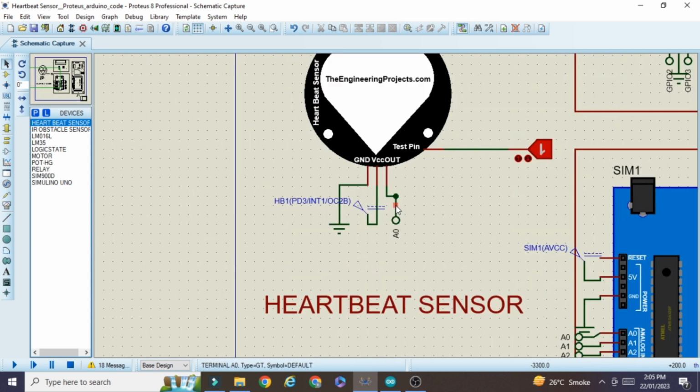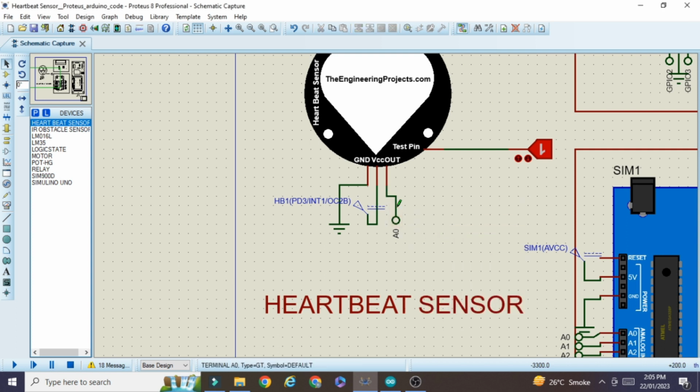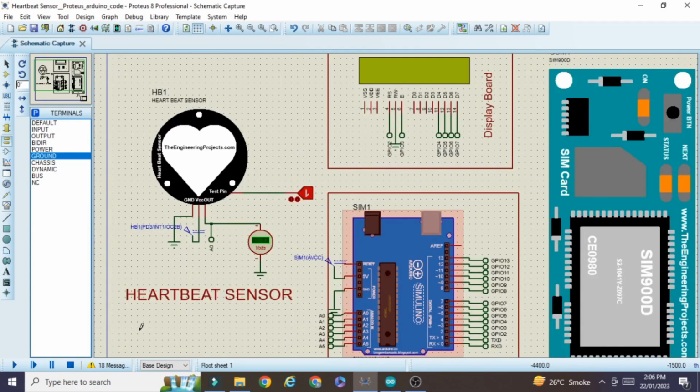You can see that up to here we have connected to the A0 pin like this. Let's say I will delete this object. Up till now we connected the A0 pin till here. Then here you can find the voltmeter, DC voltmeter. Connect that voltmeter to here like this. The positive pin of this voltmeter should be connected to here, and the negative pin should be connected to ground. So go to terminal mode, click on ground and place that ground here, and only then will your project work successfully.